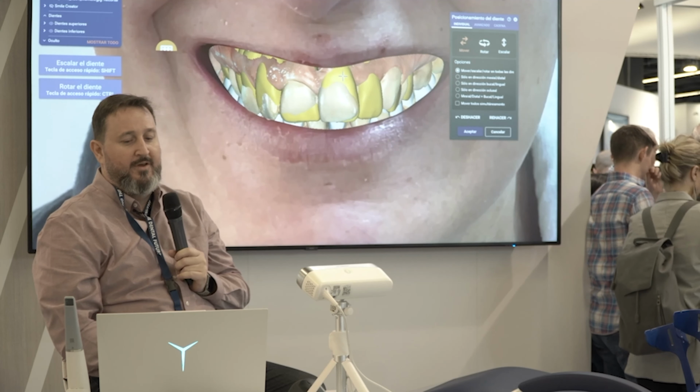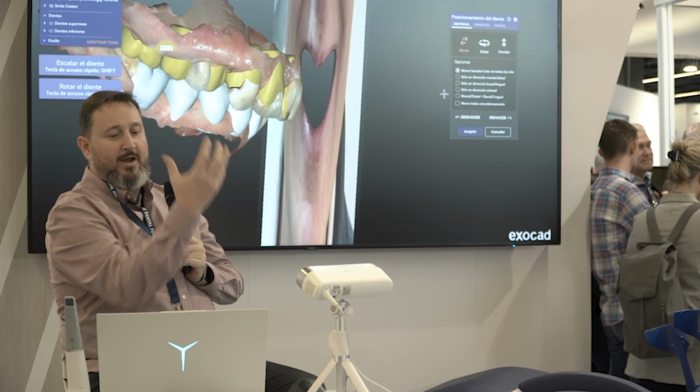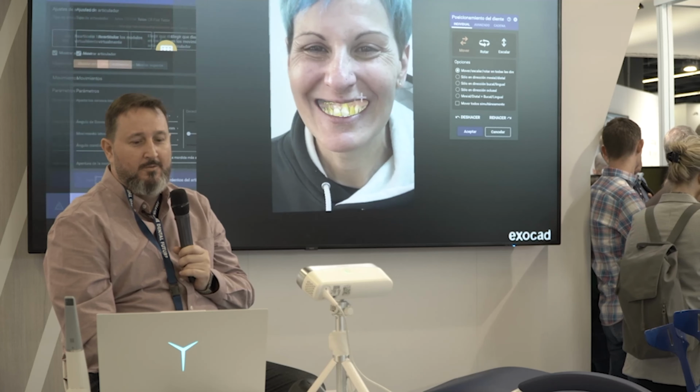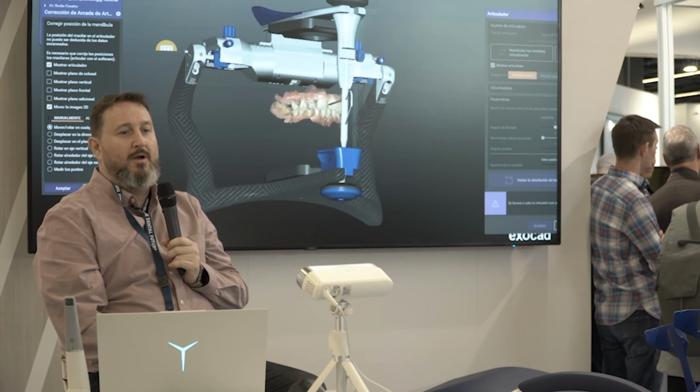Okay, now we have the position, now we move the tooth. When I have the articulator, I move it. Look what happens when I move it. I don't like this way, but I have to work in this way. Let's see what happens with the articulator. I place it, everything looks all right.